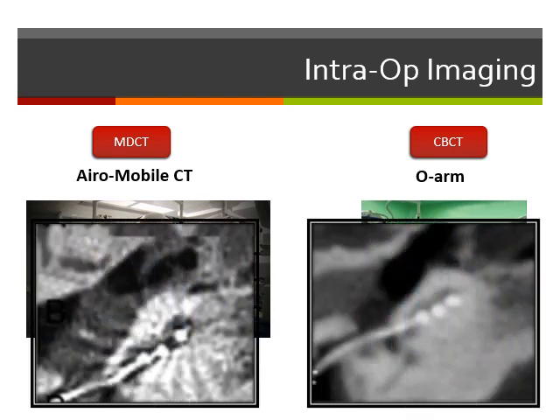This is another picture for another example. As you can see here, there is much better spatial resolution than the classical multi-detector CT. And look here, this white line represents what we call metal artifact, because the electrodes are titanium. The electrodes are metal, so they can give some sort of metal artifact around them, which cannot be seen in the cone beam CT. And this is the privilege of the cone beam CT.